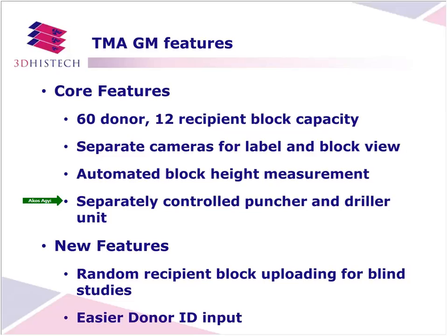Our TMA Grandmaster users can enjoy some new features. Recently, we introduced a random recipient block loading direction, which is really useful for blind studies.